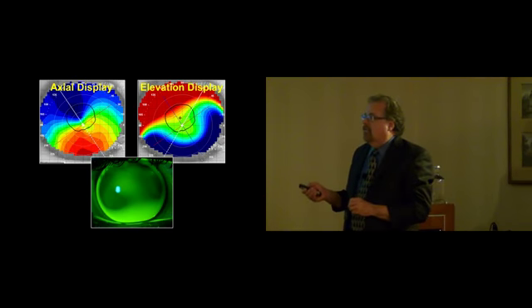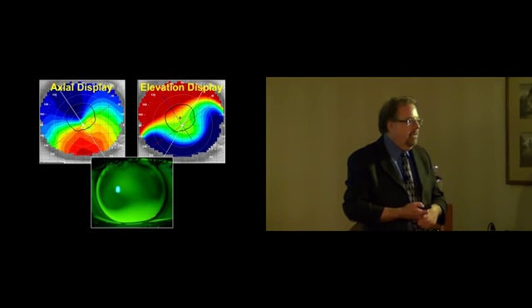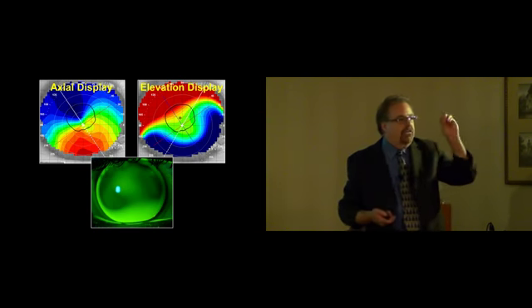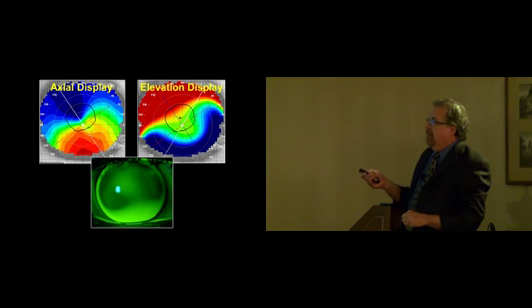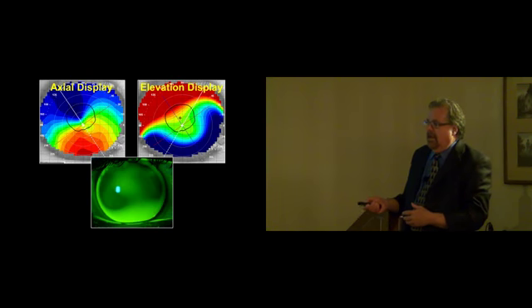Now, let's take a look at this corneal topography here. Obviously, a patient with moderate keratoconus. Ask yourself that fundamental question. Where is the cornea the highest? Where is it the lowest? Well, we can look at our elevation map, and our elevation map says it's actually highest up here and lowest down here. Now, how is that? Well, why is that? Because the red is indicating here. But what we're actually seeing here is something that is very important.